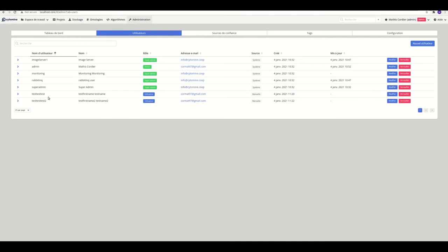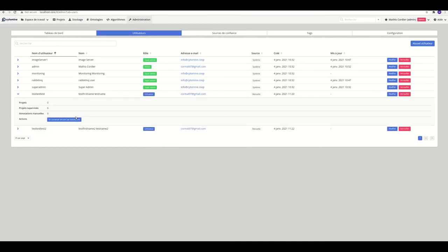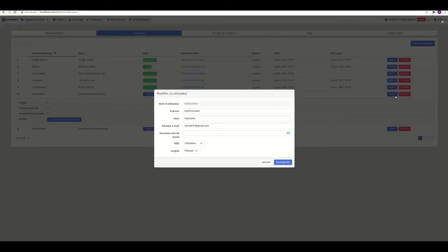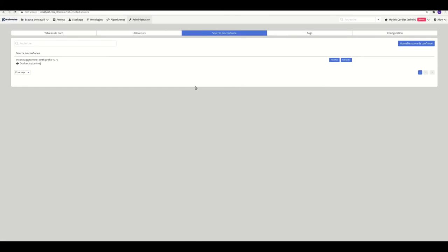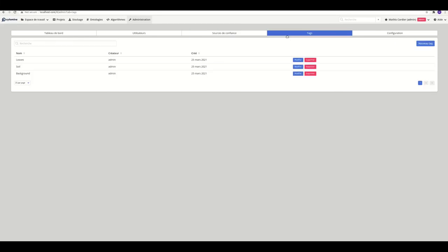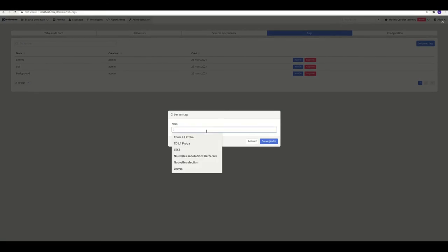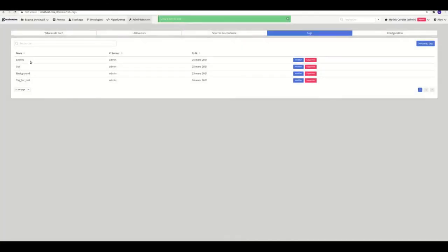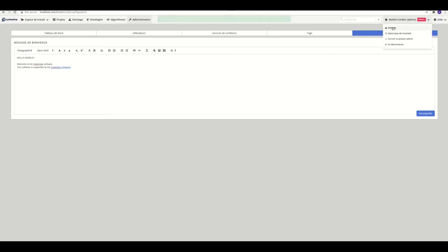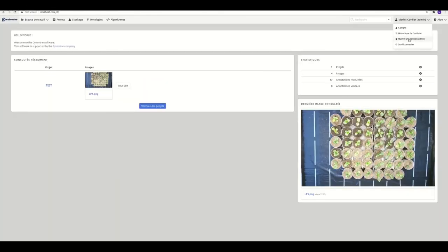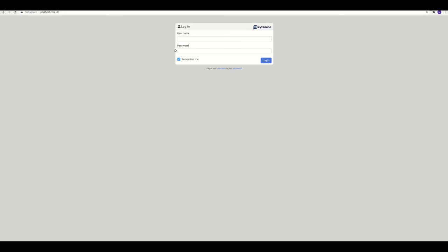So you can here manage all the users' accounts. You can set up the names, the email addresses, the passwords, logins. You also can define what is Cytomine's sources. So here it is Docker because we installed it with Docker. You can also manage the tags you want to use for your projects. So here we have leaves, soil, and background. We can add a fake label tag for test. And we can also set up the configuration of the welcome message when you enter the interface. And you can close the administrator session to come back to the login screen.